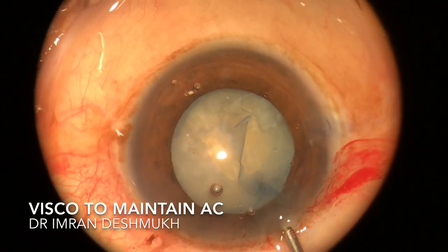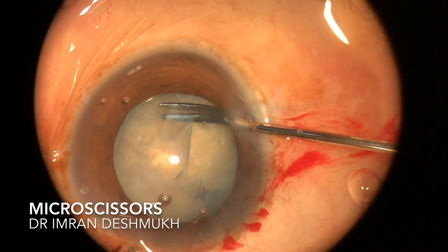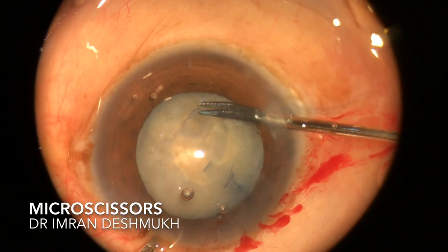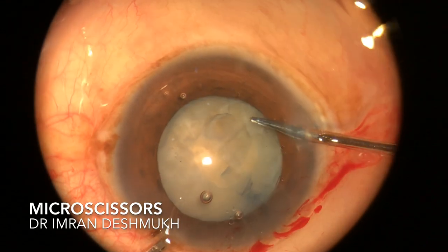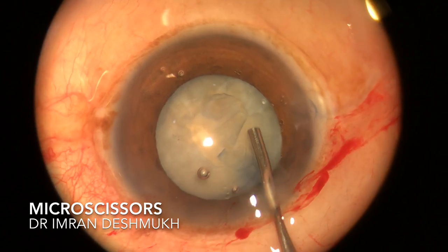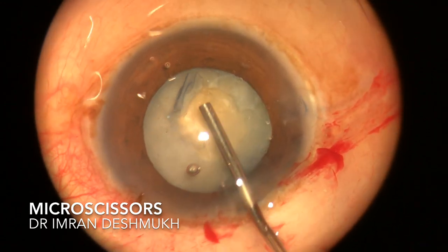Make sure you use a lot of visco, maintain the anterior chamber, and you can use a little visco beneath the capsule. I entered through the side port and used my micro scissors to increase the size and length of the rhexis. You have to be slow and very careful — make sure you don't extend the rhexis to the periphery. You need a good round circular five-millimeter rhexis.